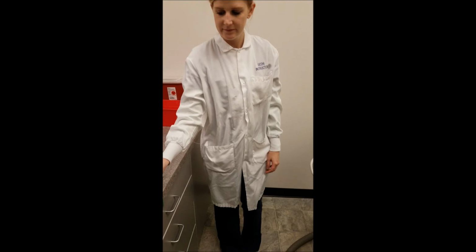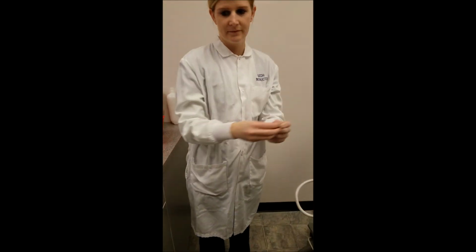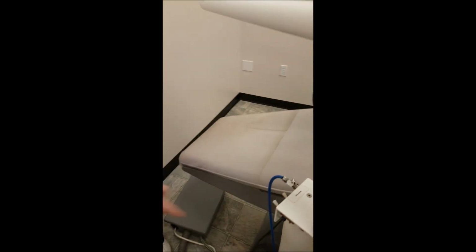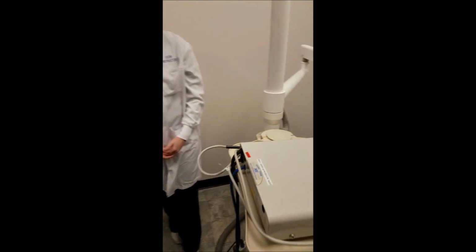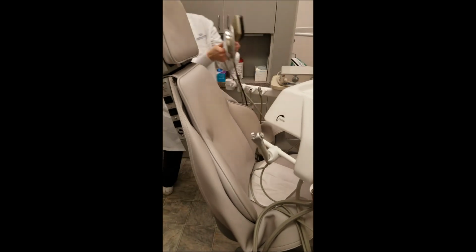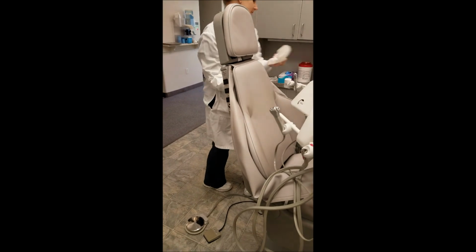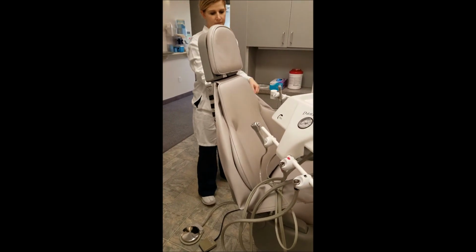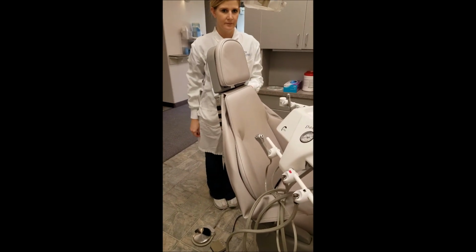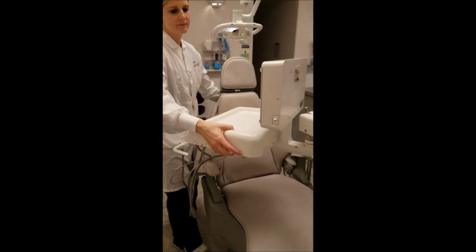She will add the blue tab each time before filling, if she needs to. And then she will turn on the water switch. So you just flip those up right there. Awesome. And then she will remove the rheostat and ultrasonic foot pedal from the top of the patient chair and place them on the ground. And then she will lower the patient chair and then she will turn on the master switch. It's just right back here.